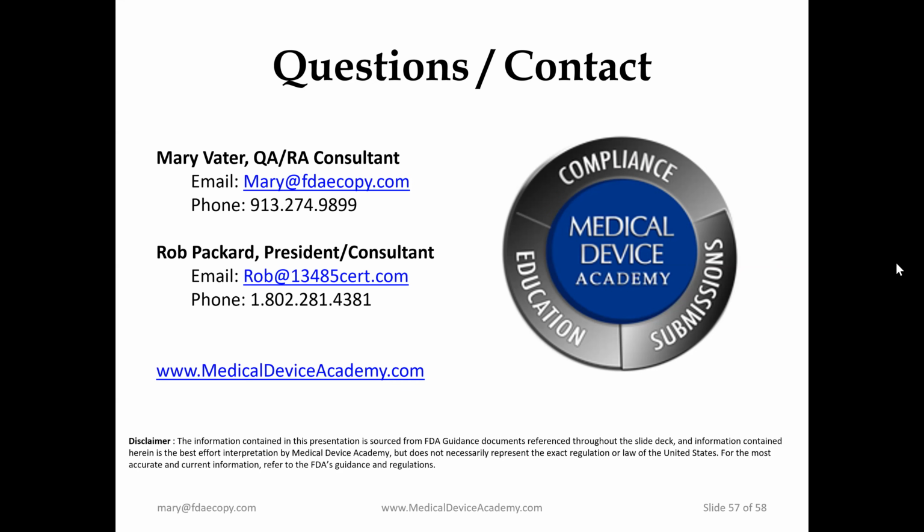Okay. So the FDA seems to use OTS for off the shelf instead of SOUP. And if not, what's the difference between OTS and SOUP? There's definitely a difference. Typically when the FDA references OTS, they're talking about commercial off-the-shelf software, like Windows or Git, or some of these commercial applications that you can purchase that you might use with your software.